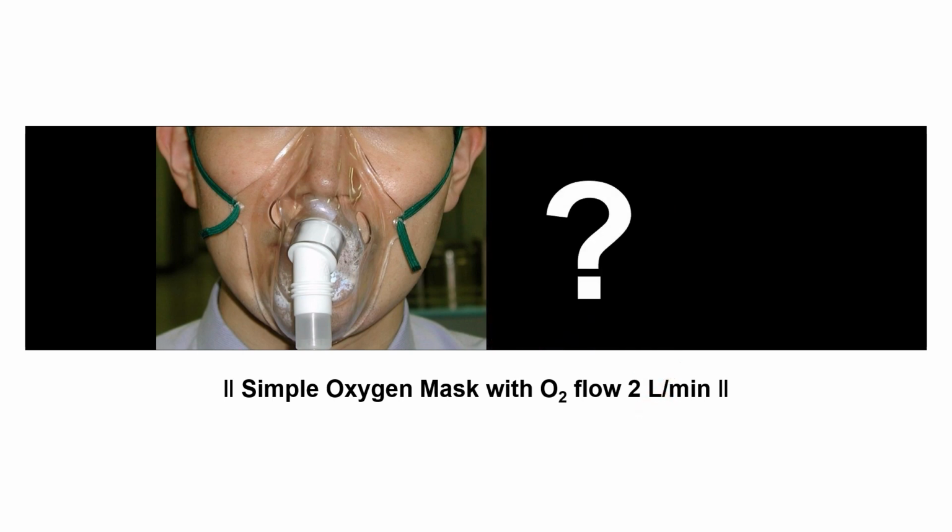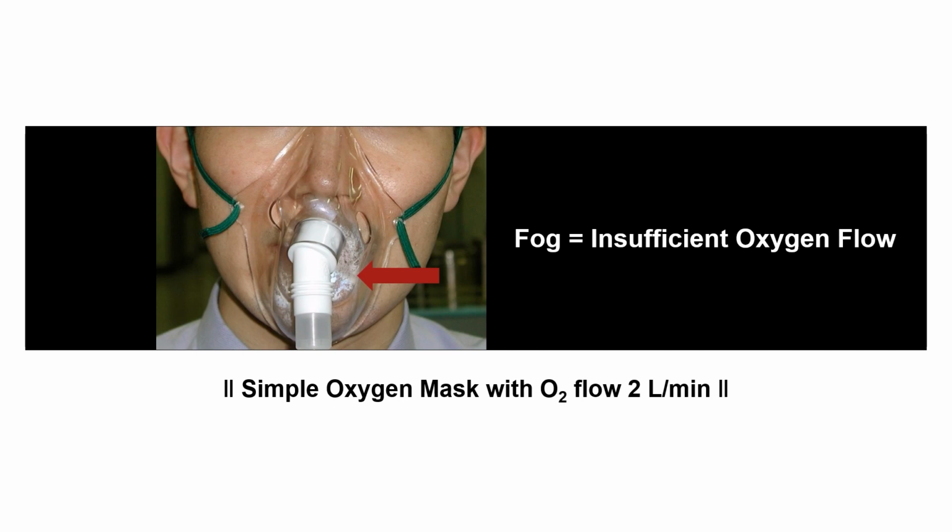Even without looking at the oxygen gauge, there is an indicator that can inform us if the oxygen flow is insufficient. Specifically, if there is fog inside the mask, it signifies that the oxygen flow is not adequate.